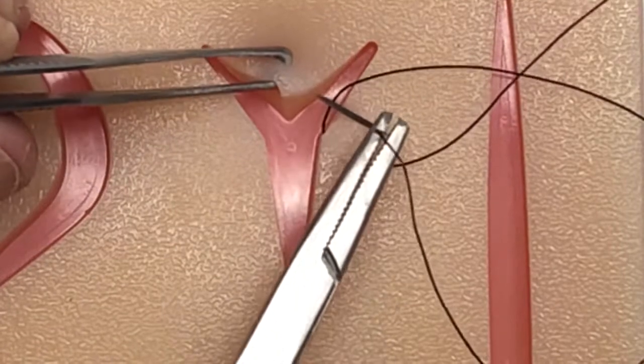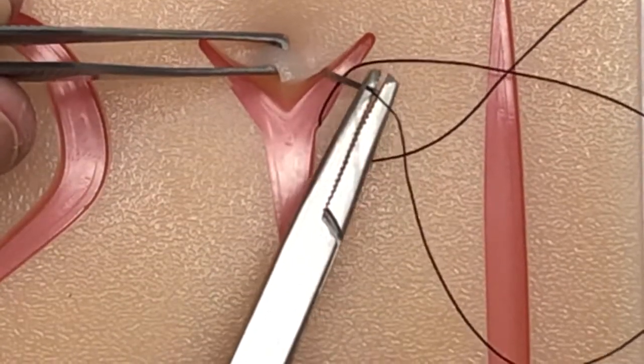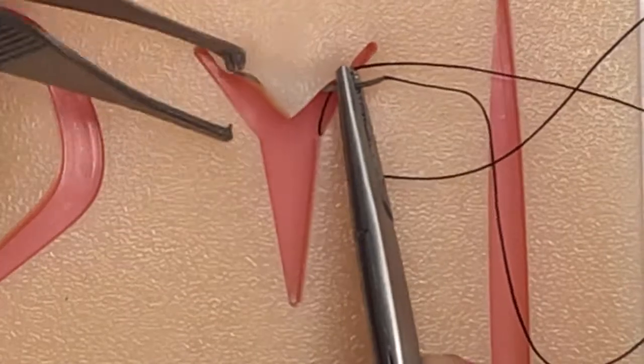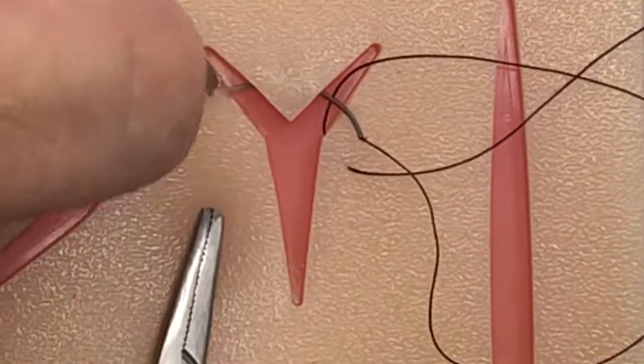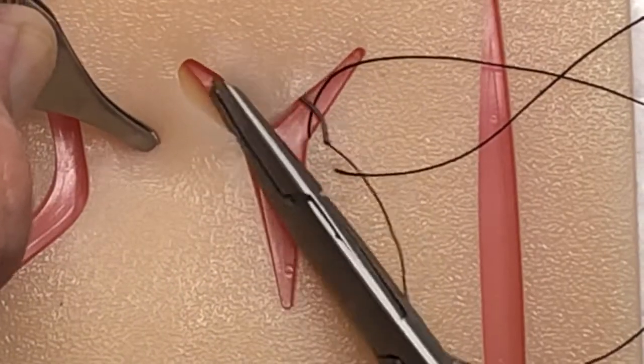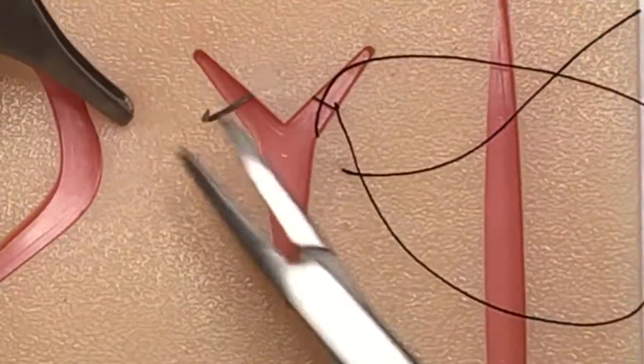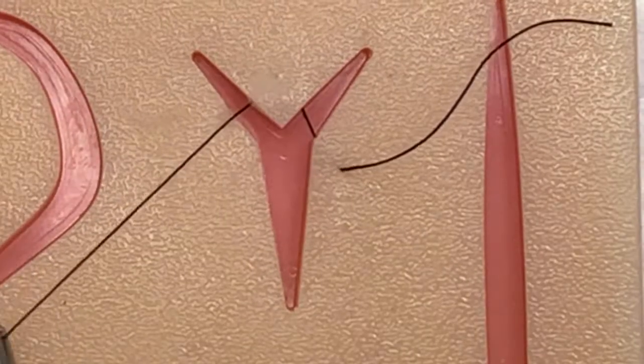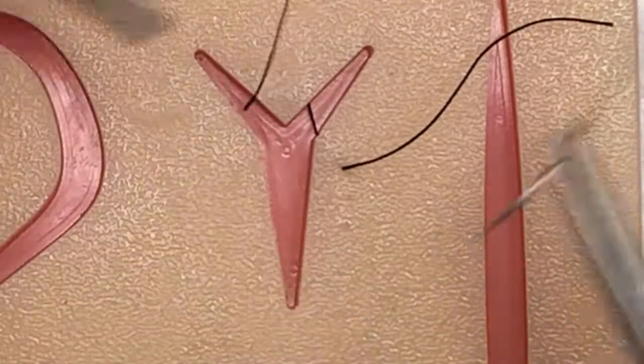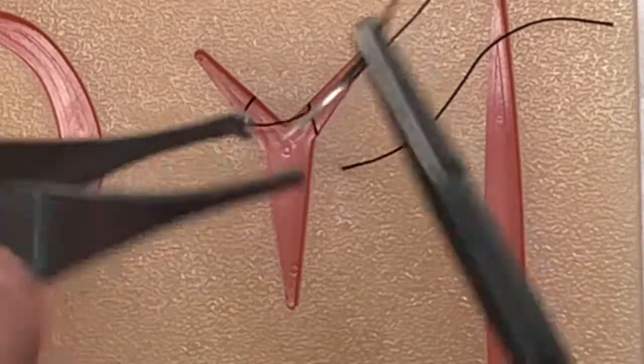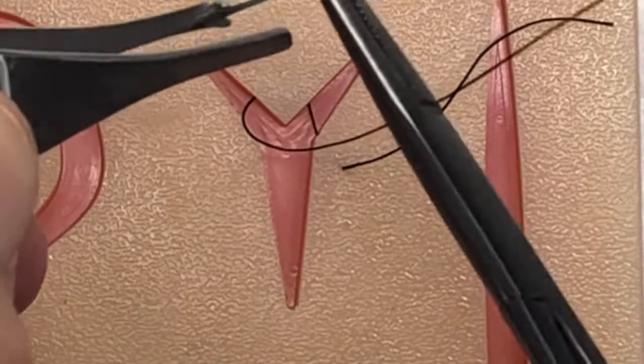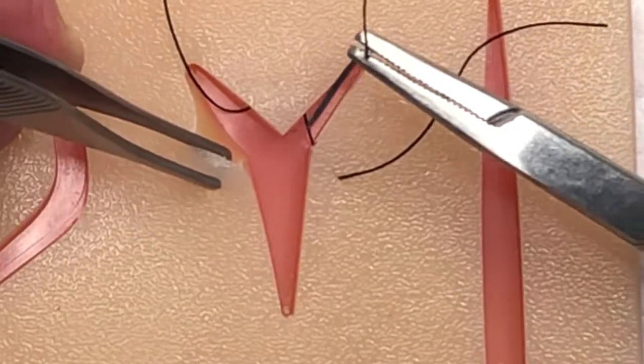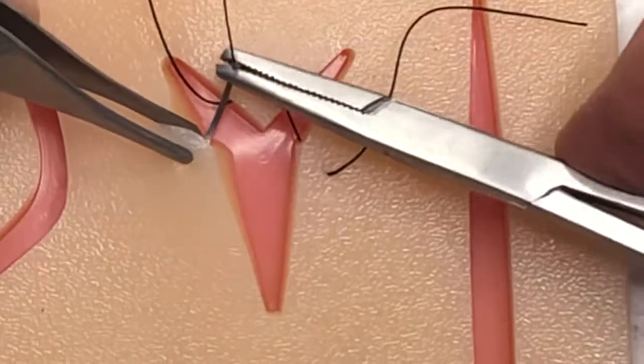So I'm going to go on this side here, kind of in the dermal area. And then I'm going to come through on to the other side. Grab the needle with my needle driver here. I'm going to just grab it. Pull it through. And then I'm going to reload my needle driver. And then I'm going to use my tissue forceps. Come through and through.